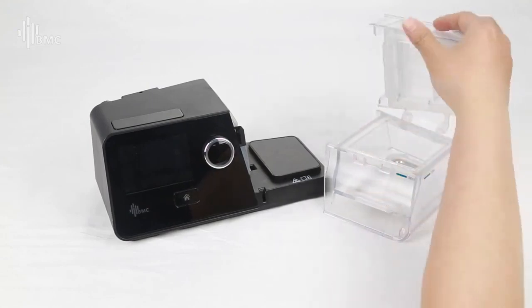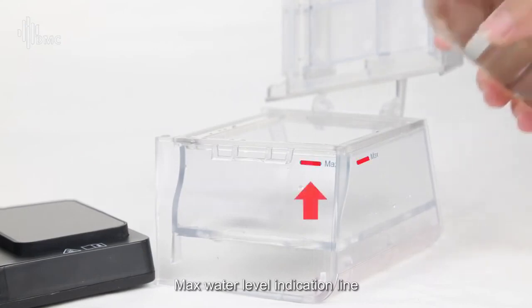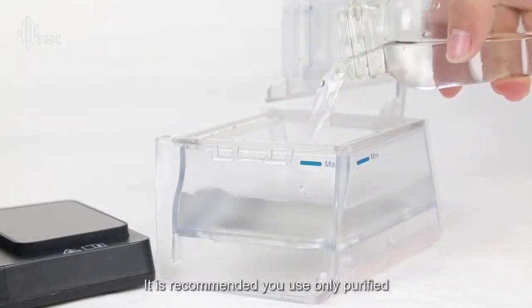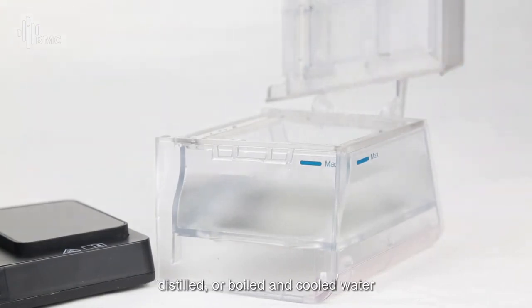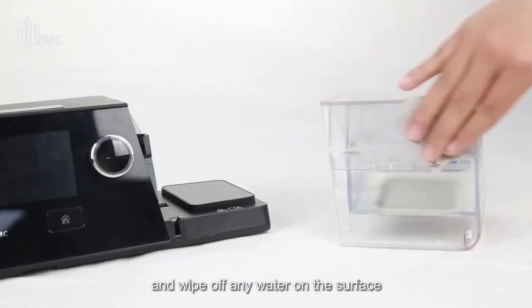Open the cap and pour water into the chamber up to the max water level indication line. Do not overfill the water chamber. Please replace the water daily. It is recommended you use only purified, distilled, or boiled and cooled water. Close the cap of the water chamber and wipe off any water on the surface.